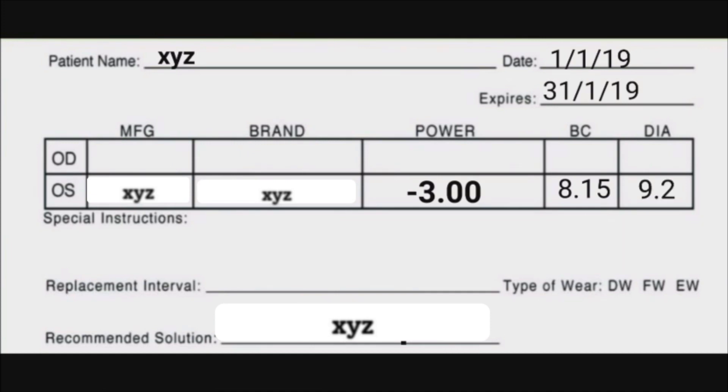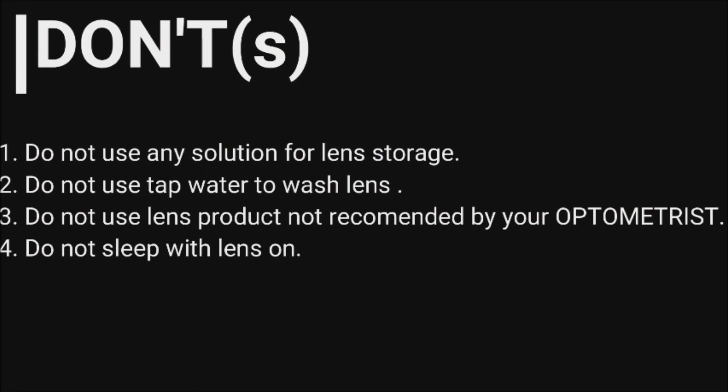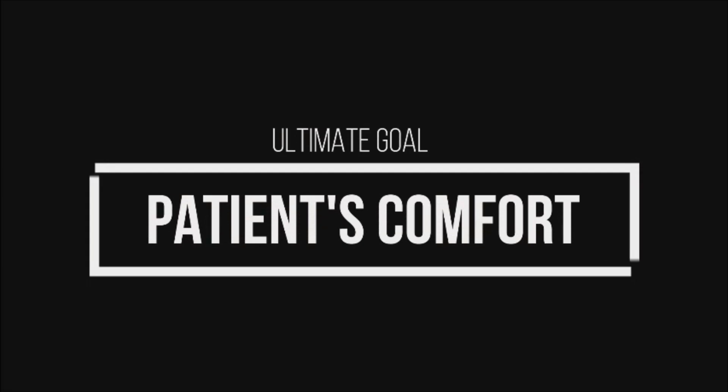This is the final lens prescription. Some points to be avoided while using RGP lenses. Our ultimate goal is the patient's comfort, and hence the patient is happy.